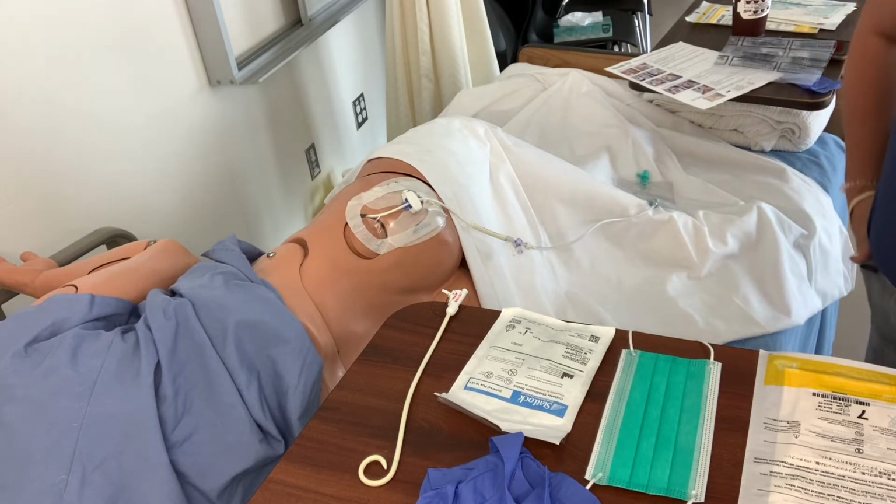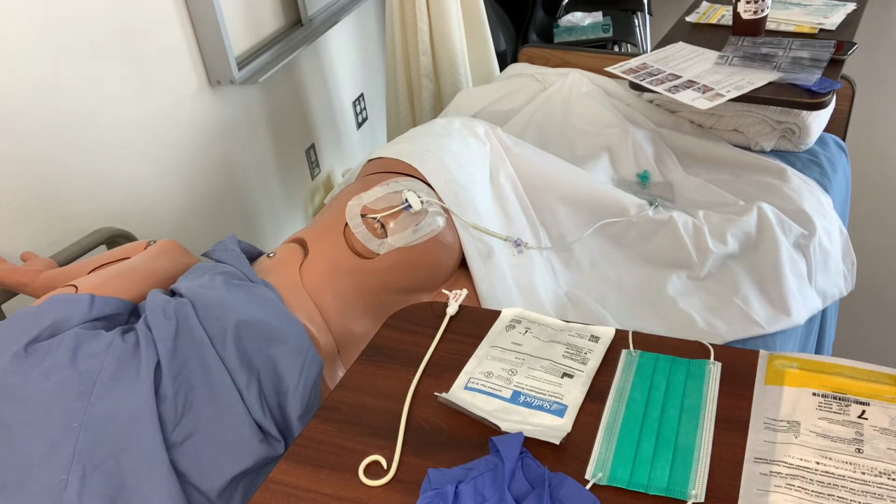It can be inserted in a patient for a variety of reasons and in a variety of locations. It'll be your responsibility to understand why your patient has a specific catheter and the care that's associated with it. We don't actually teach this in lab, so I thought this would be helpful. It is quite common in clinical practice.